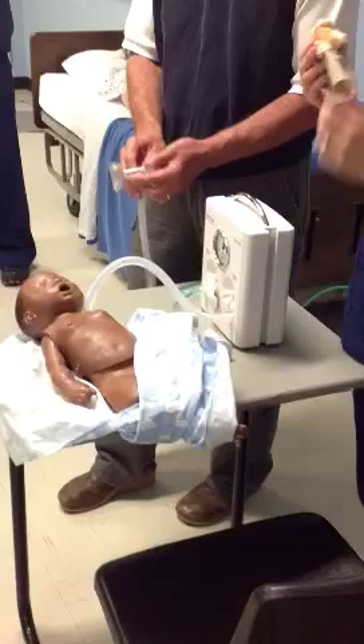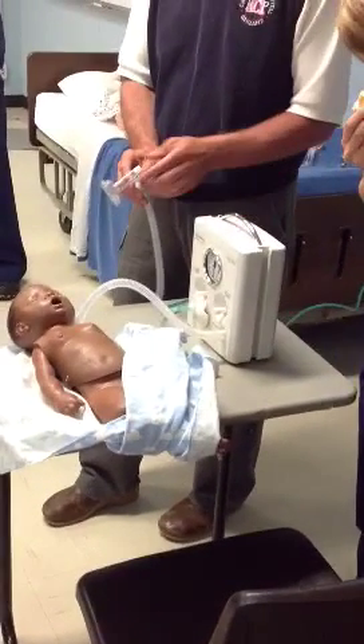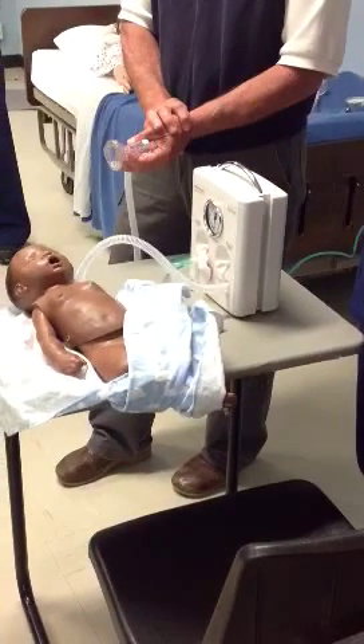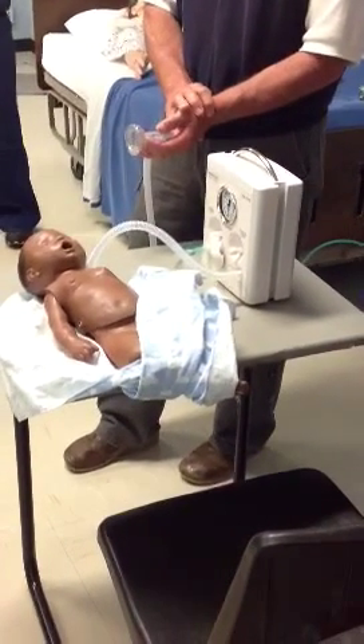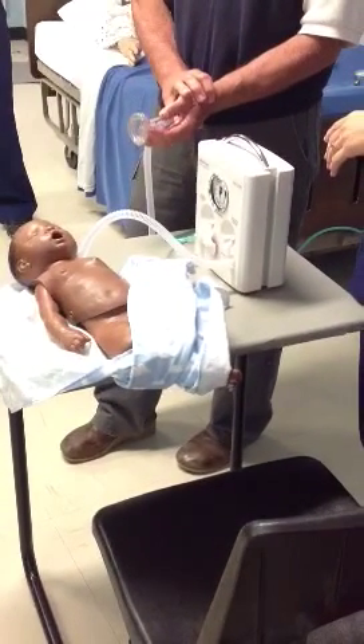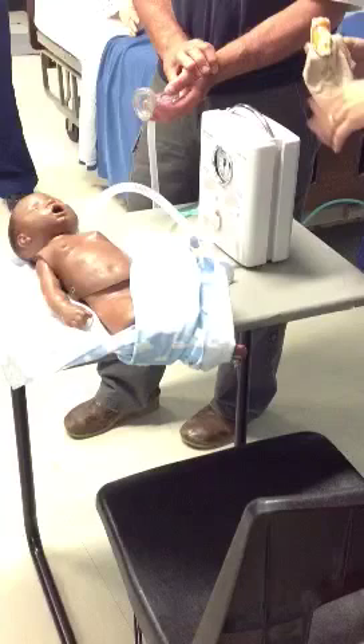That's a disadvantage. All right, so what's the other main advantage of this device? There's one more. It's light and portable. But there's one other really main advantage of it. Does it mix the oxygen and everything? Yeah.